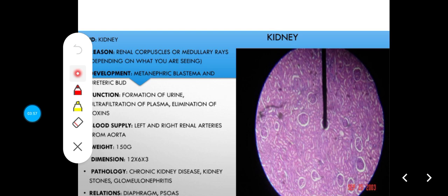Also, you can find the convoluted tubules, the proximal and distal convoluted tubules, in the cortex. You can find numerous proximal convoluted tubules and then a few distal convoluted tubules. You might not really be able to appreciate the tubules in this image, but the key to identifying them is that the proximal convoluted tubules stain better than the distal convoluted tubules. The proximal convoluted tubules contain simple cuboidal epithelium and a layer of brush border, so the lumen might seem indistinct.